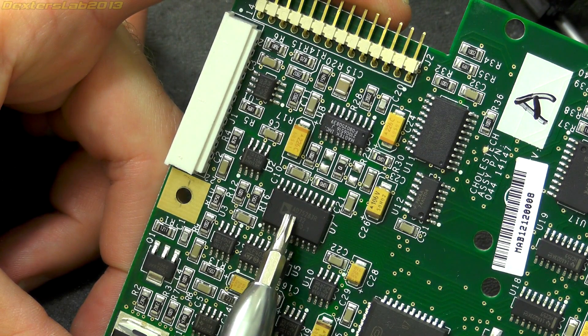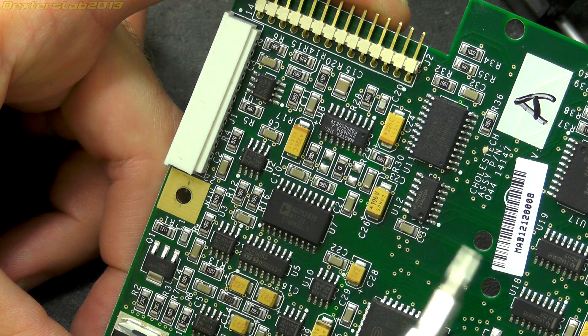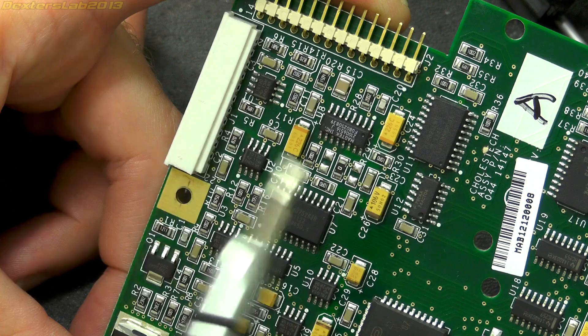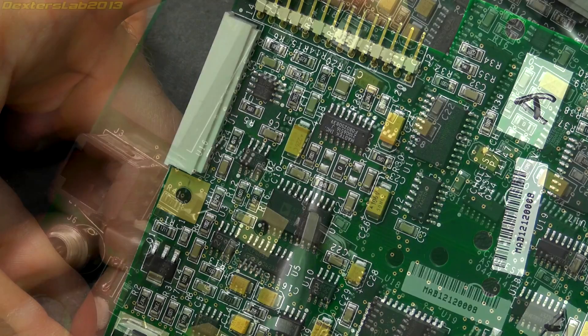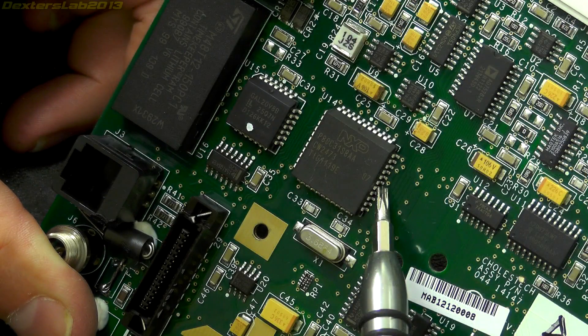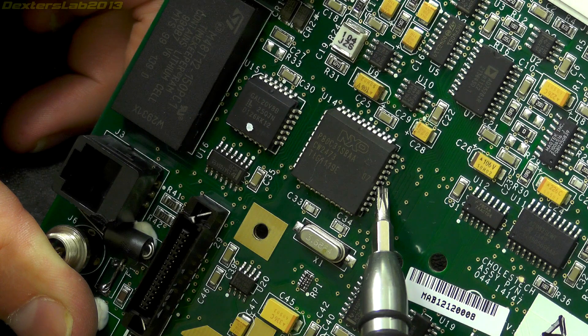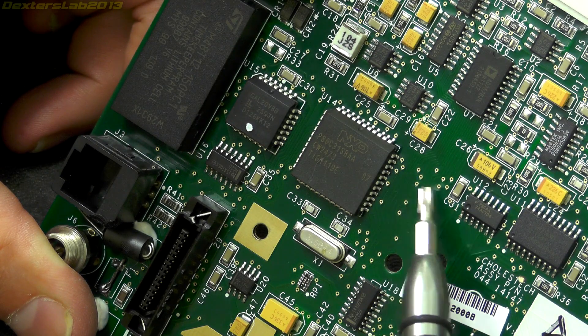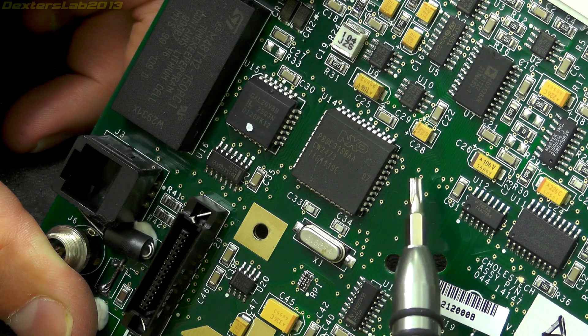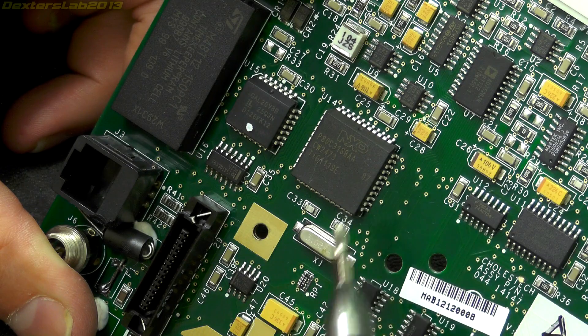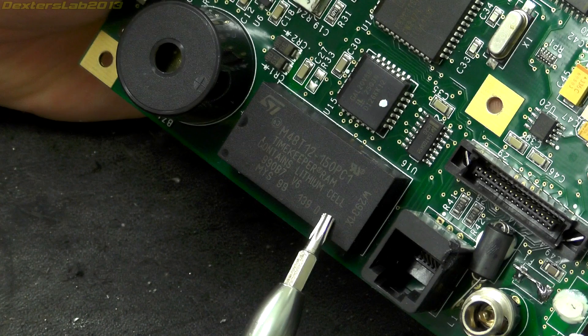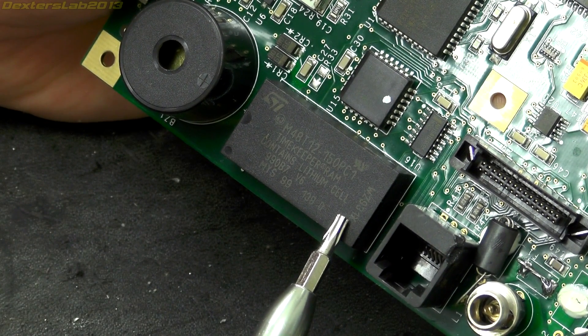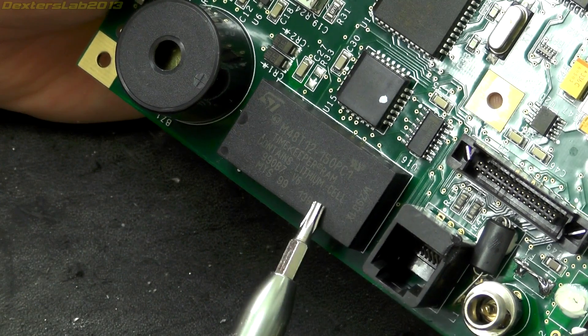This device here is Analog Devices AD7528. It's not the ADC at all—it's actually a DAC, dual 8-bit buffered multiplying DAC, so they've actually needed some DAC control for something there. The NXP processor is a P80C31SBA, which is an 8051 CPU. We've got 4kx8 ROM, 128x8 RAM, three 16-bit counters. The battery-backed RAM is an ST Micro M48T12-150 PC1, so that is 2k SRAM and real-time clock.